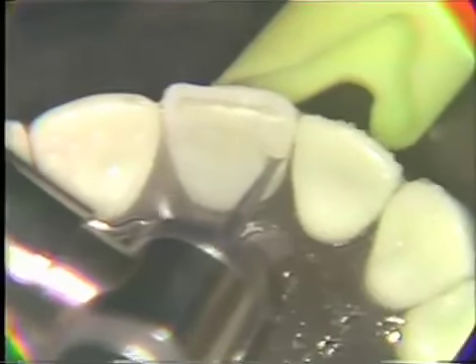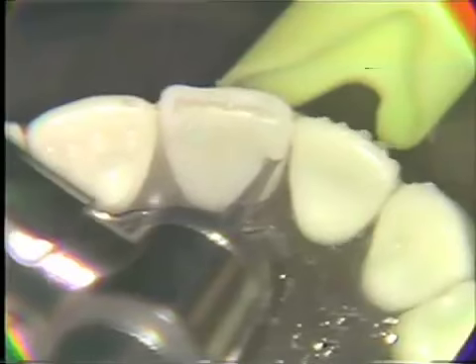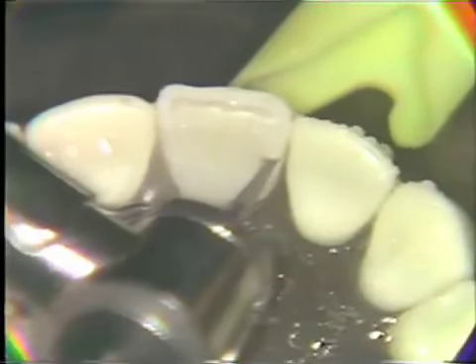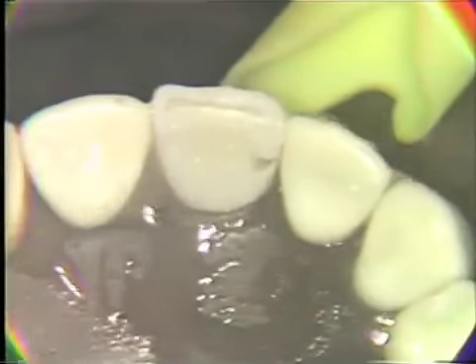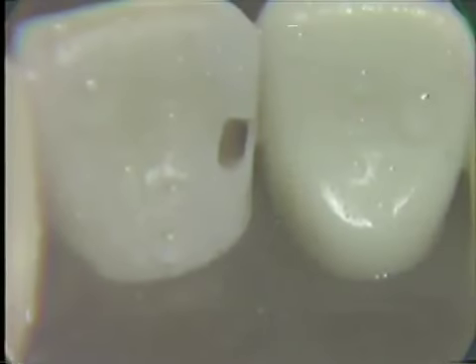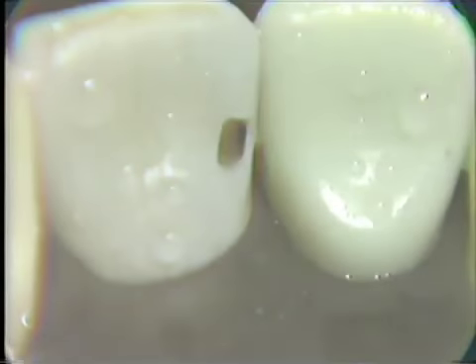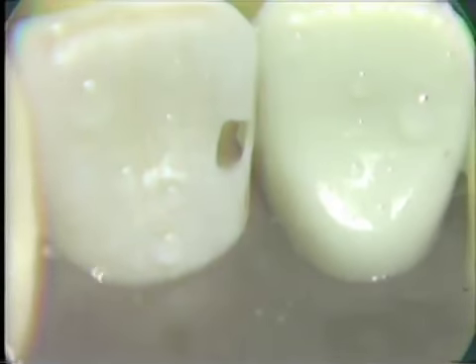We want to make sure that the labial cervical area is in a more cervical position than is the lingual cervical area. We have the preparation now completed.